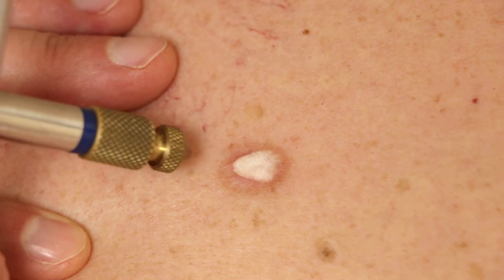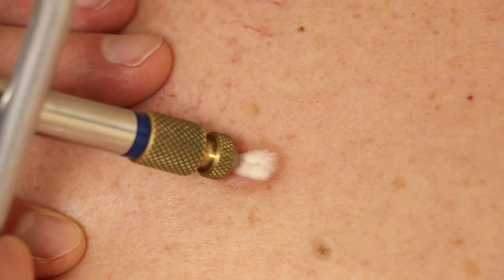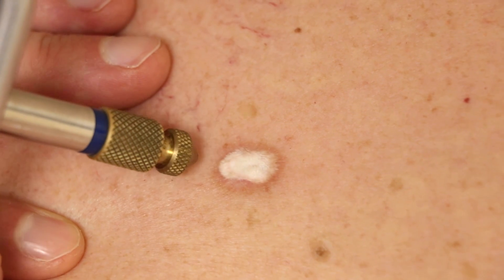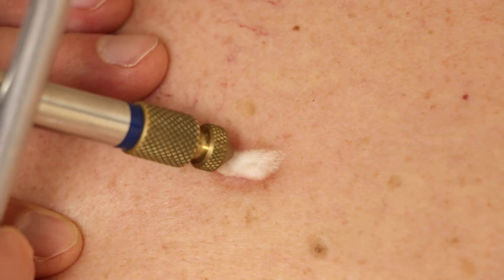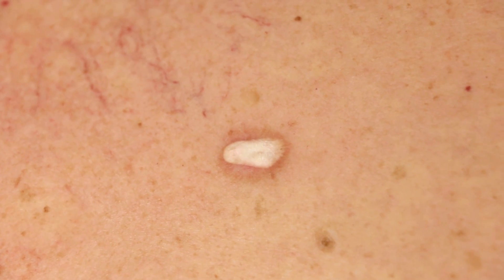That covers the whole thing, but we want to keep it frozen for a while — a good 20 to 30 seconds or so. Then we'll let it thaw out, and then we're going to repeat the freezing of it. This is to produce frostbite, which will blister up as frostbite would heal.